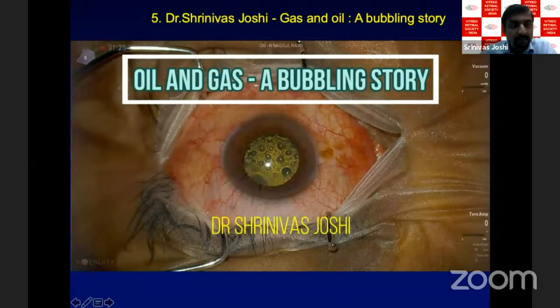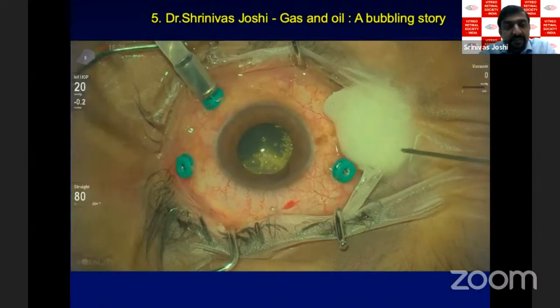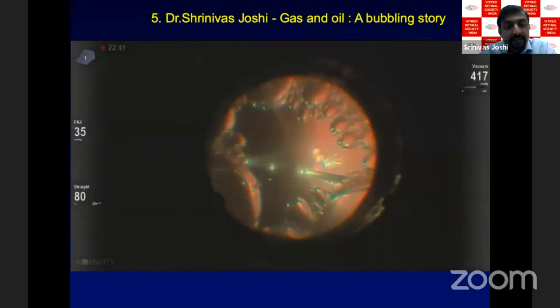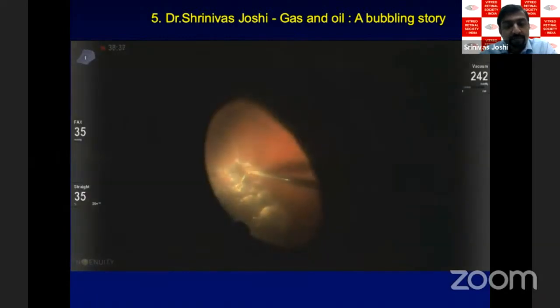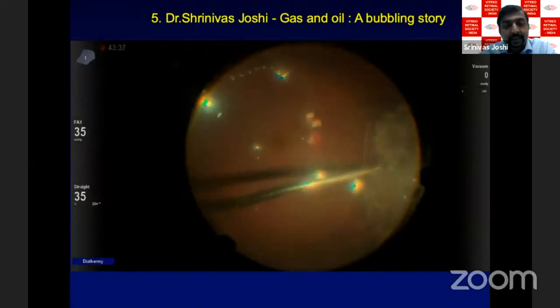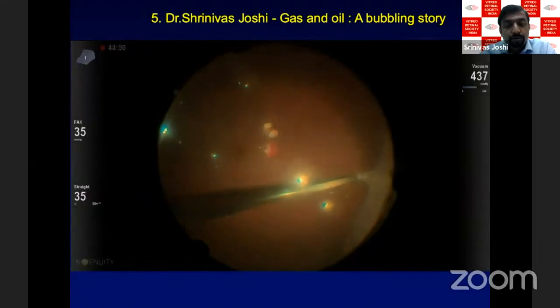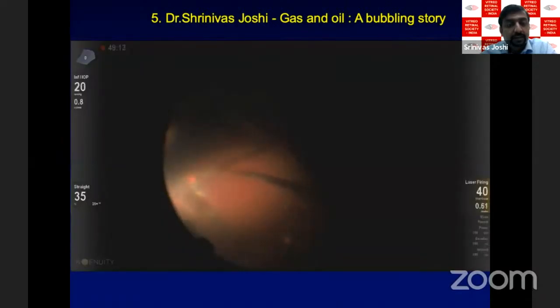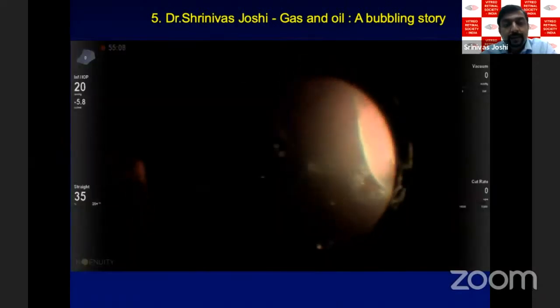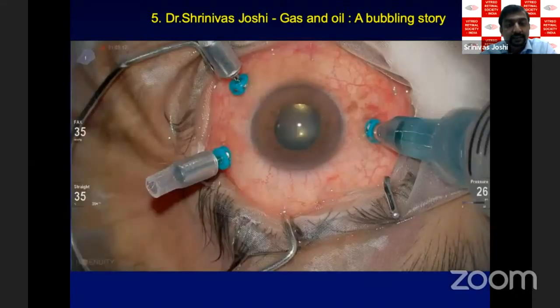Good evening, everyone. So I'll be speaking on the oil and the gas, a bubbling story. So here the patient presented with retinal detachment. I did a pneumatic retinopexy with SF6 gas. Post 2 days, that gas started forming fish eggs. So many fish eggs that it went even subretinal at many places. Now you can see there's another area where it got trapped. So ultimately I had to do a retinotomy in that area and try to remove those bubbles. I checked for any additional breaks, and then lasered the breaks. And then finally, I put oil in this case.